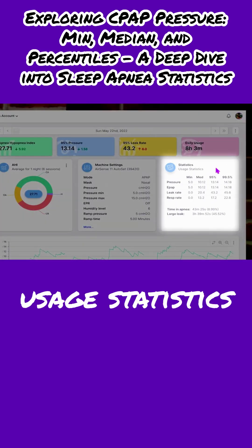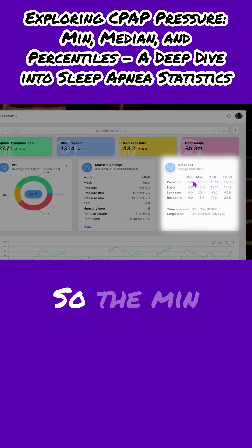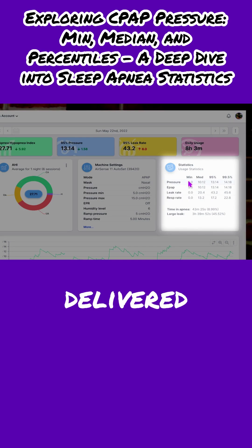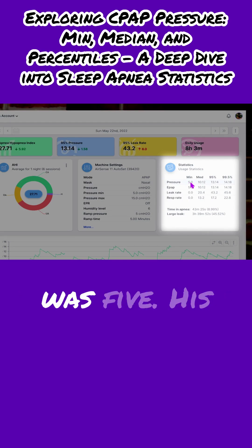We have the usage statistics right over here. So the minimum pressure delivered, the lowest pressure delivered throughout the night for Jay was five.